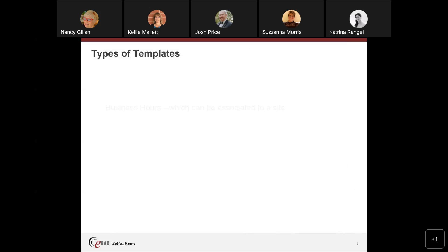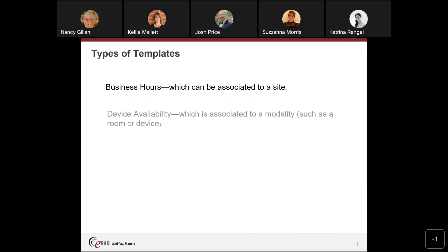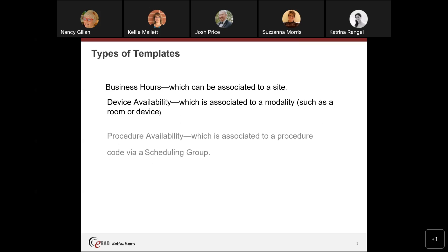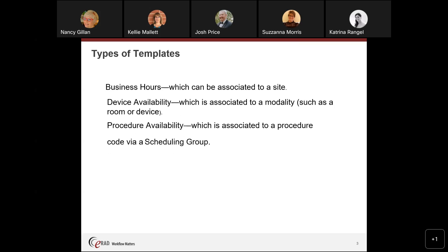There are different types of templates. The first one is business hours, which can be associated to a site, so different sites can have different business hours. Device availability is when the room or the modality is open — your front office might open at 6:30, but you don't start x-raying people until 7 or 8, or certain rooms can open at different times. Then we have procedure availability, which is associated to a procedure code via the scheduling group — certain procedures might be done only at certain times, like biopsies only certain times of the day or days of the week.